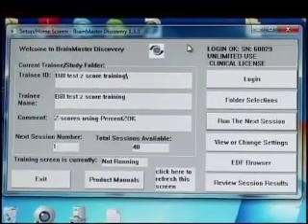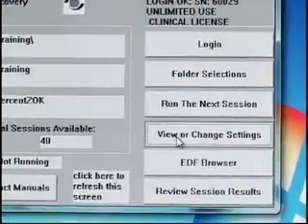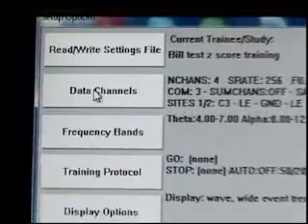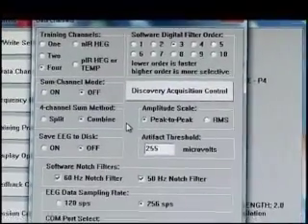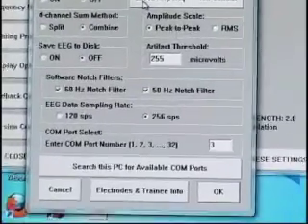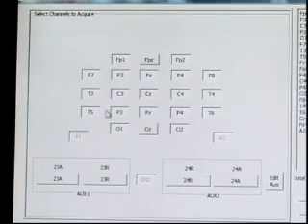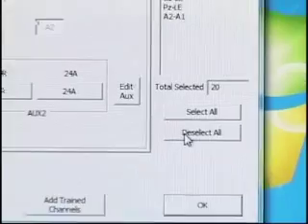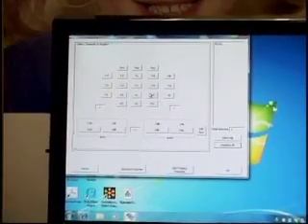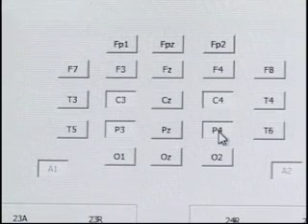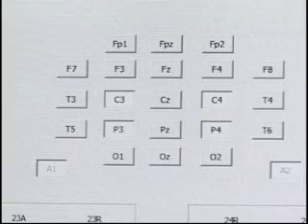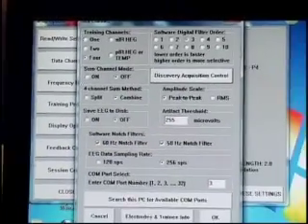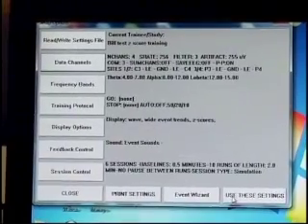I then go back to Viewer Chain Settings, up to Data Channels. What we're looking for, slightly down on the right-hand side, is the Discovery Acquisition Control. At Discovery Acquisition, we see all 19 channels are listed — we don't really want that. So we simply deselect all, then choose the sites we want to train: C3, C4, P3, P4, our two references for linked ears, and our ground. We hit OK, hit OK, and hit 'Use These Settings.'